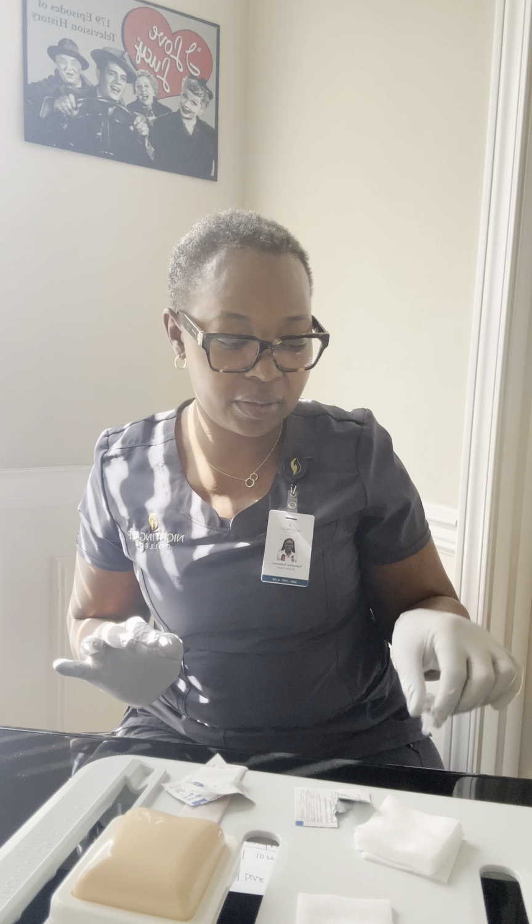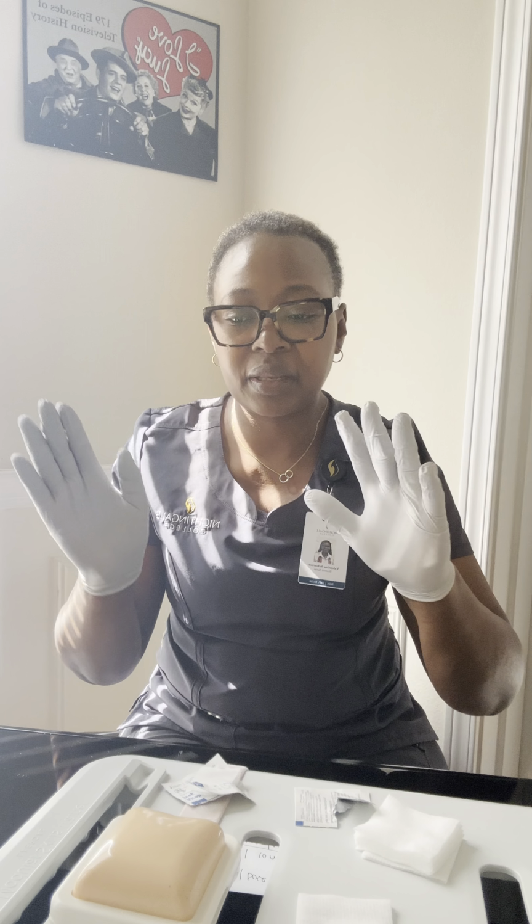I'll secure that. I'll then inspect the skin to make sure there are no masses, no skin breakage, edema, and no other concerns on the skin. And I will palpate using my fingers in one hand to feel that I have enough skin to accommodate the needle that I have. So yeah, I see that.